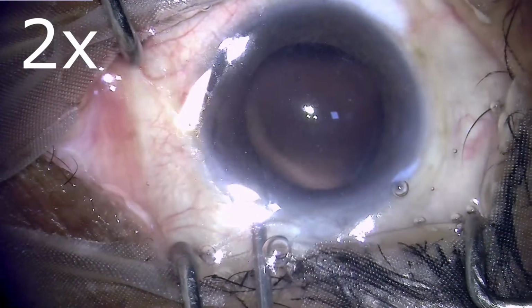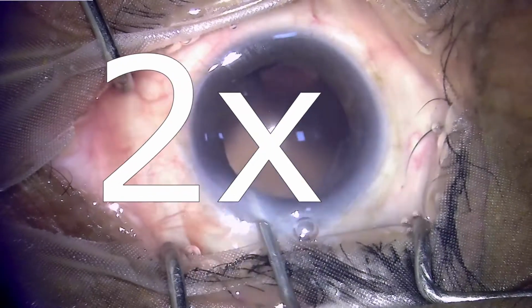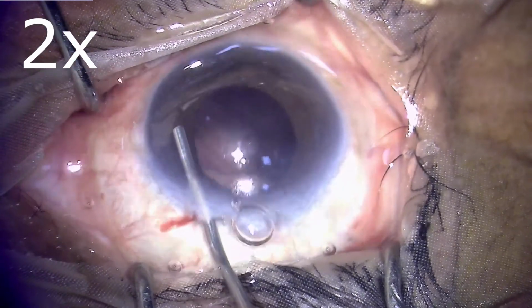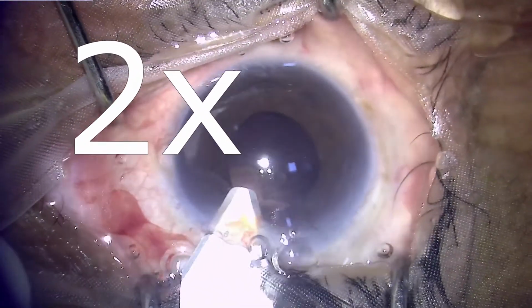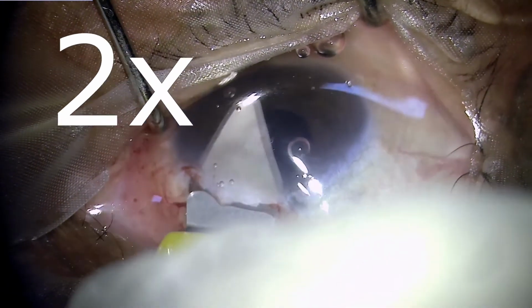First of all, neutralizing the mydriasis by injecting pilocarpine, and then forming the anterior chamber and retaining the viscoelastic there. So the anterior chamber has been formed here, and now I'm enlarging this incision a little bit so as to accommodate the anterior chamber IOL.